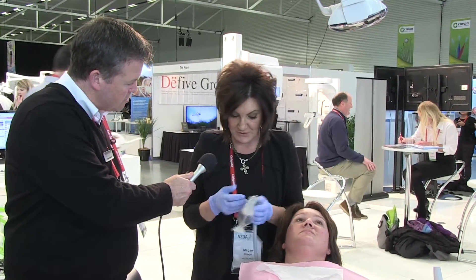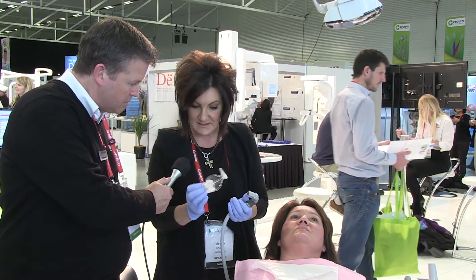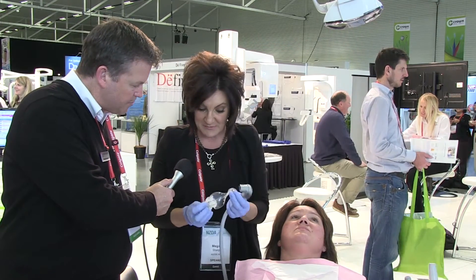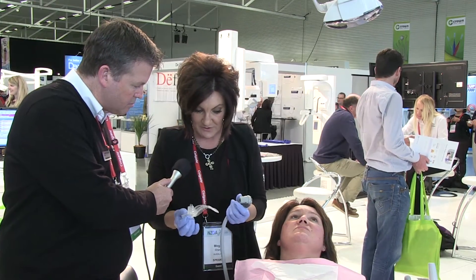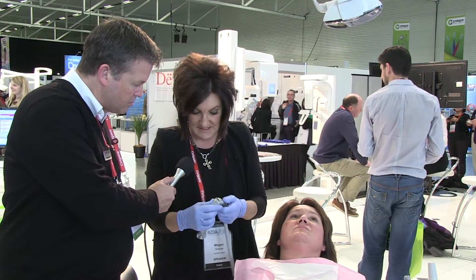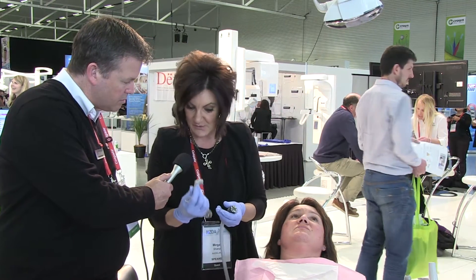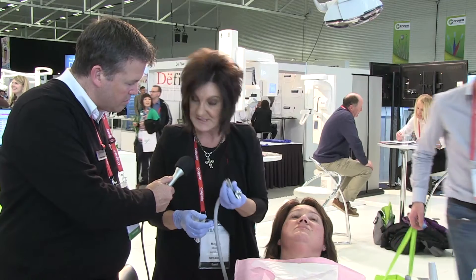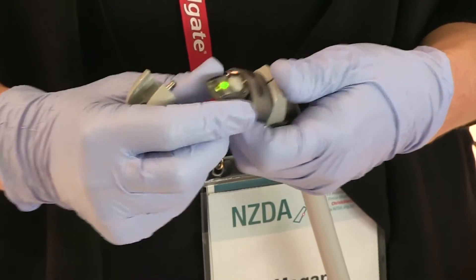This is the unit — it comes in three pieces. This is a plastic polymer, so this is the mouthpiece, which is the bit that gives you entire control over the oral environment. These pieces are part of the entire system; this is known as a vacuum pipe, and these are sterilizable between patients, so each patient has a new piece.